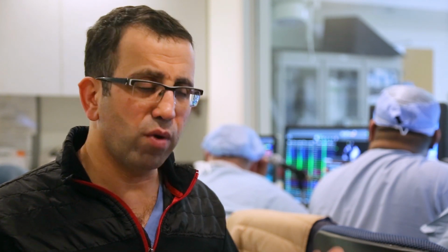We are here looking mostly on the patient that have recurrent episodes and the veins have been chronically isolated. So then you are left with two options. One is to do empiric ablation of multiple lines, but then the price is that you are going to encounter probably recurrent macro-reentrant circuits.